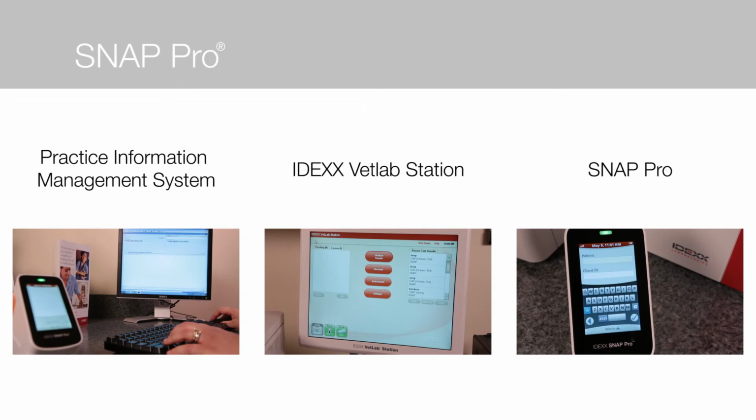If the Snap test run was started at the Practice Information Management System, once you select the checkmark, the results will then be sent back and stored in your Practice Information Management System. If the Snap test run was started at the IDEXX Vet Lab Station, once you select the checkmark, the results will be sent back and stored in the IDEXX Vet Lab Station. If your Snap test run was started directly on the Snap Pro, once you select the checkmark, the results will be stored on your Snap Pro. The last 100 Snap test results will be available to be viewed on the Snap Pro Results tab.